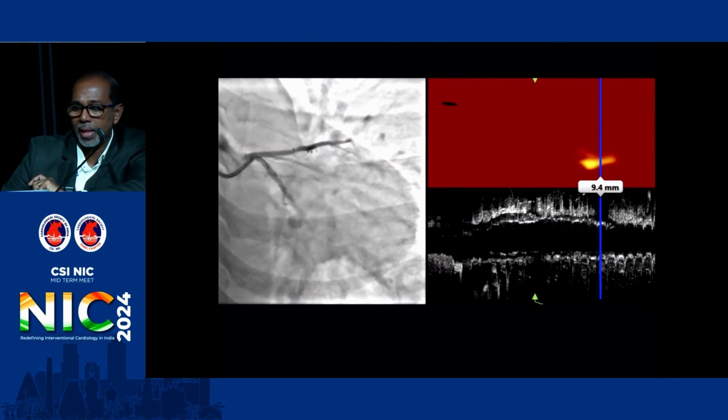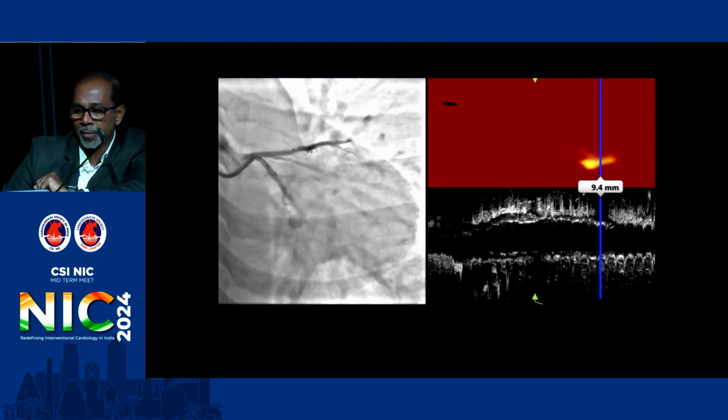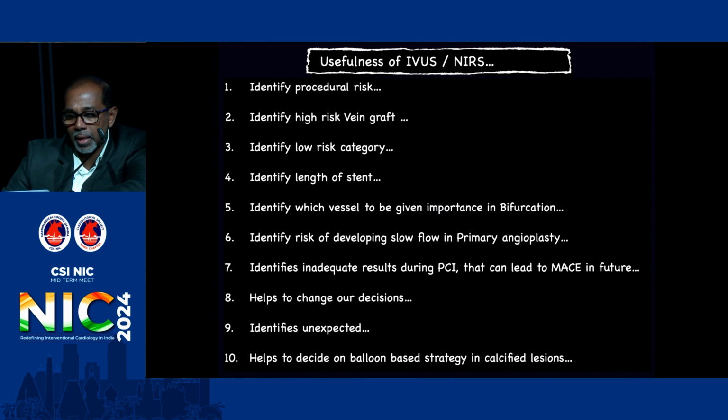However, following stent implantation, you could see at the end, in the IVUS image, that beyond the stented segment, there appears to be something yellow over there. When we evaluated that, just beyond the stented segment, there was lipid pool which was not initially present, probably because of the redistribution of the lipids pushed by the balloon and the stent distally. And that's my last case.